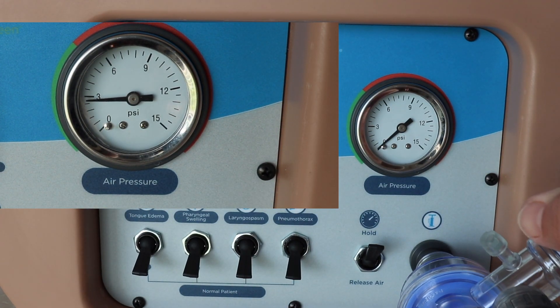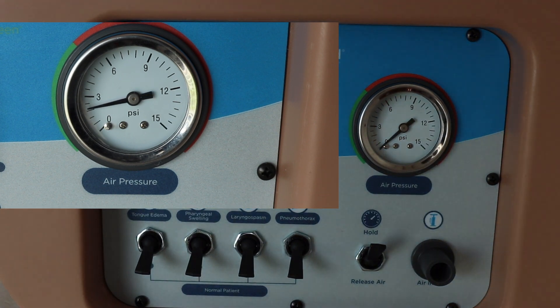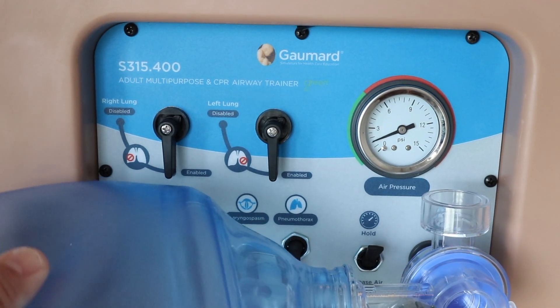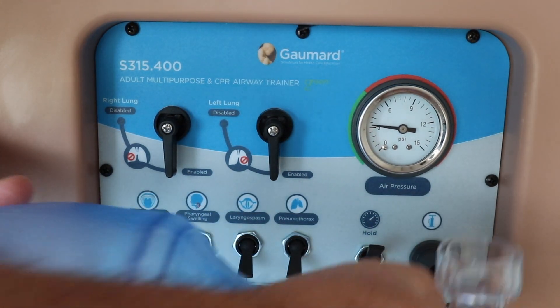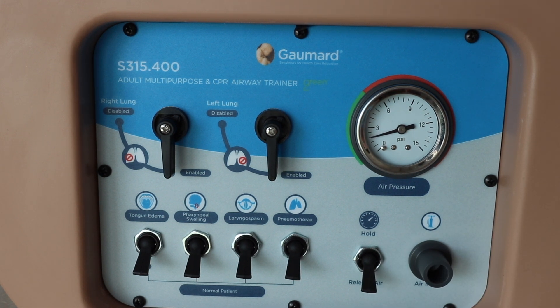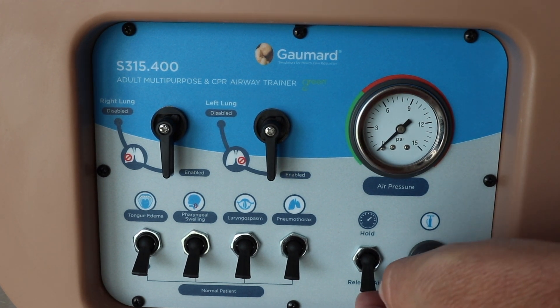You can also use the BVM if you don't have the little gray fitting that comes with it — it's kind of a pain to get on there. If you use one of the BVMs with a blow-off pressure valve, just know that you're going to have to disable that pressure valve while trying to fill the mannequin with air, because that valve is doing what it's supposed to do. Once you get the system pressurized, you can start manipulating your switches. Again, do not over-pressurize the system — you'll break it.